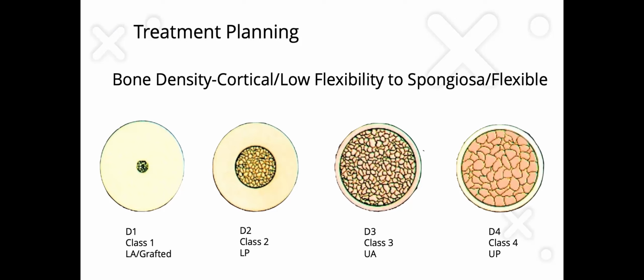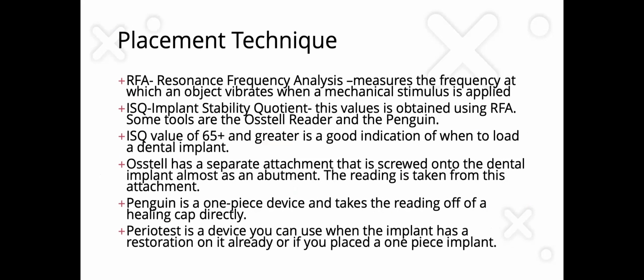I would like to have people consider having an inventory of dental implants, because sometimes when we go in with our osteotomy, we'll find out that there's not a lot of resistance at all, and we might change our mind to using osteotomes, and then maybe using a lower diameter drill as our last osteotomy, so that we can place our implant with sufficient torque.